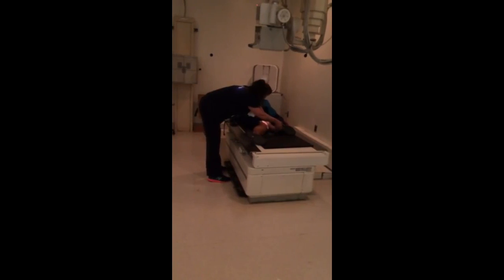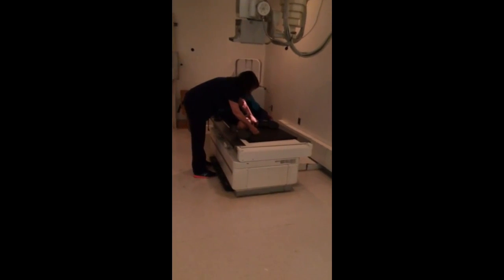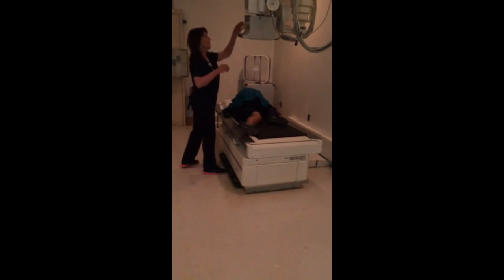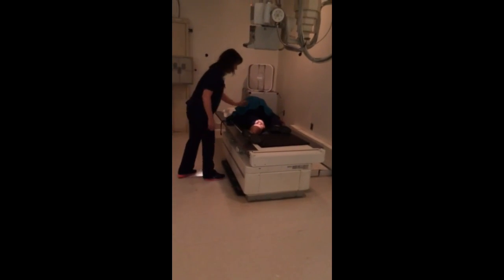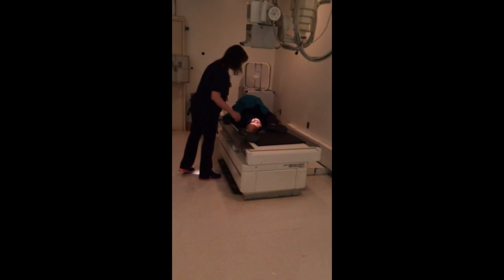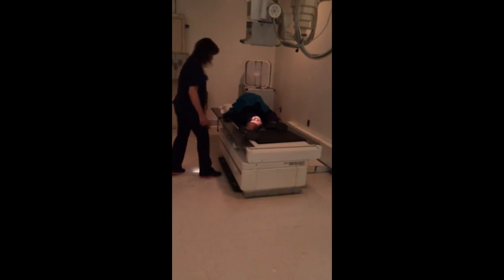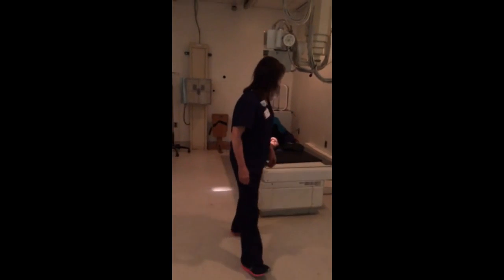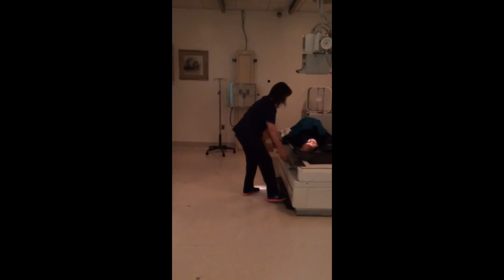And my left marker, thank you. My left marker is going to be on the lateral side. Tilted, shielded, left marker, 23 degrees angle. Collimation looks good. Okay. Stay real still for me.